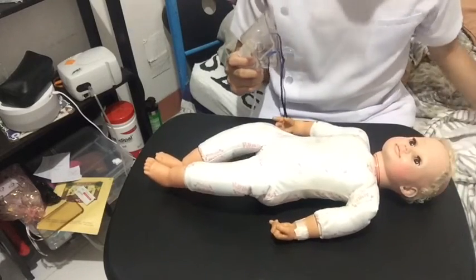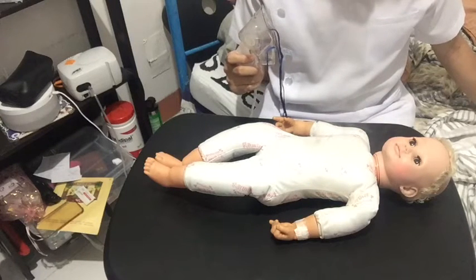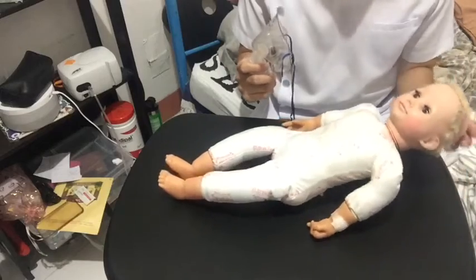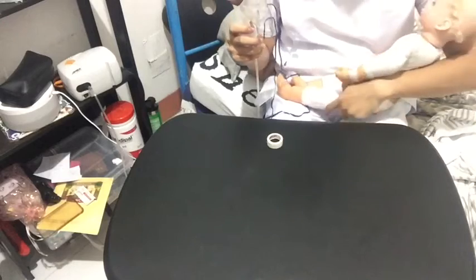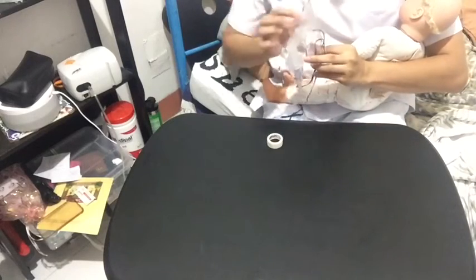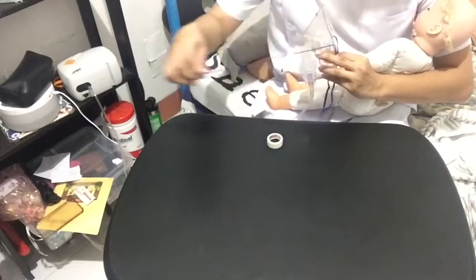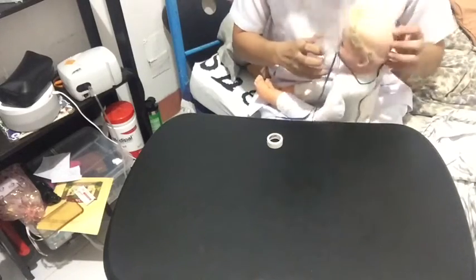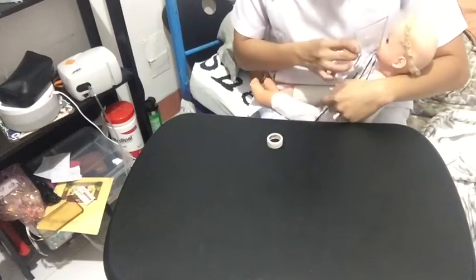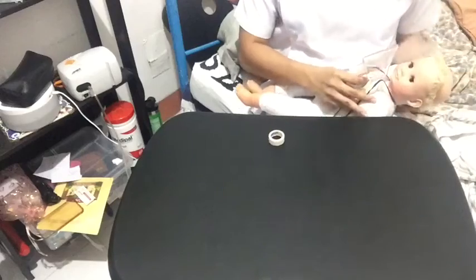Usually for babies, since babies can't hold it, what we do is we assist the baby and we use the mask. By using the mask, we adjust it to the baby's head. You can fit the baby properly.